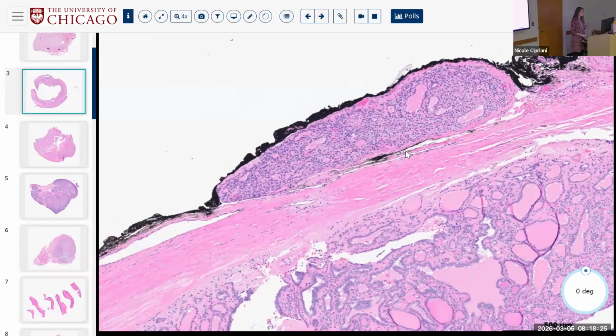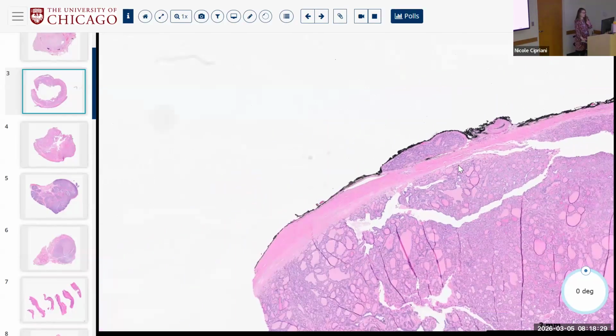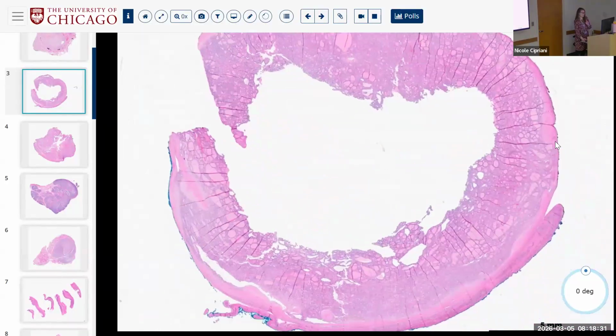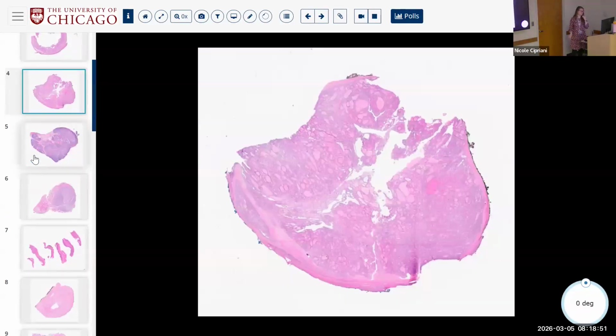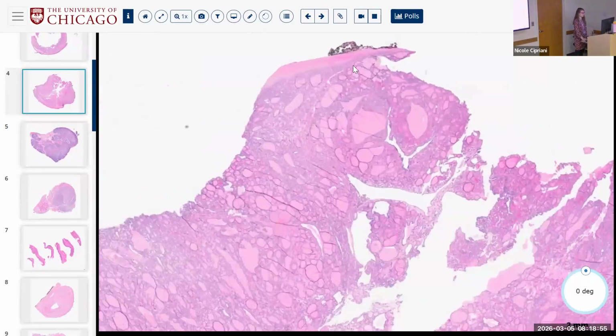Okay, good. What else? Okay, so the other thing you might want to do in this type of tumor, right, is make sure you have the entire periphery submitted, right? Because in some cases, this might have been representatively sampled. If you start seeing blips like this or that are concerning, those are the tumors you want to have the entire periphery in on. So we have another section, I don't think I gave you this, of the same tumor. This was an outside consult.